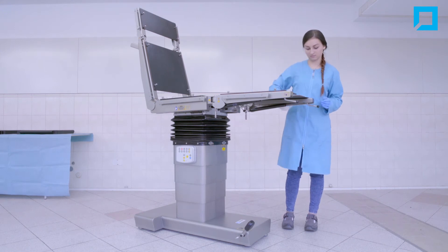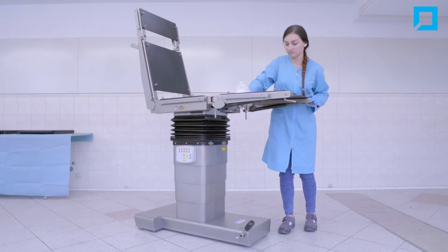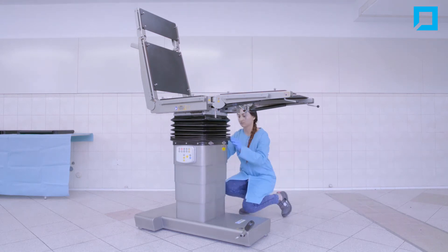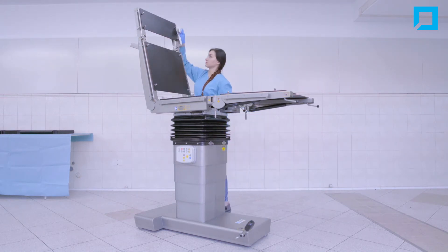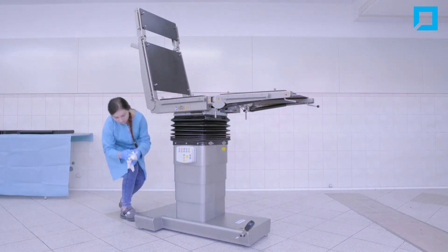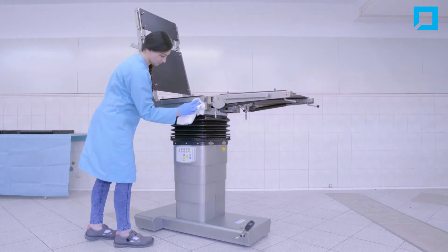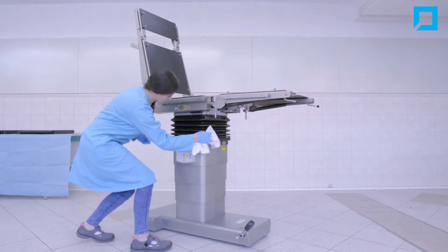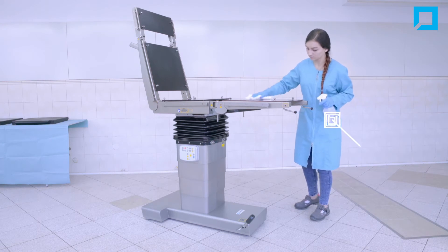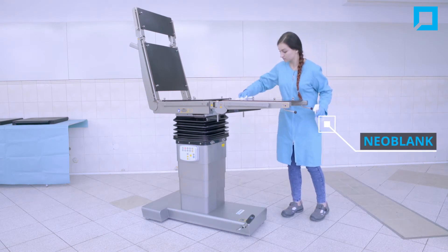Wipe the table dry. Apply a protective agent on the table surface, for example Neoblanc.